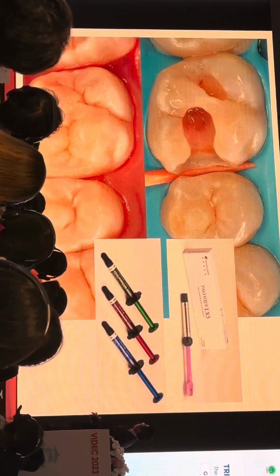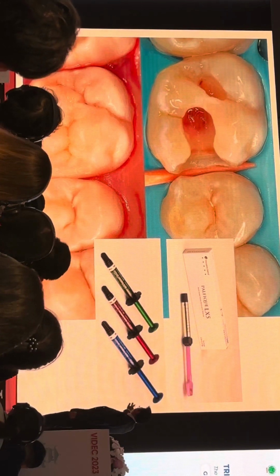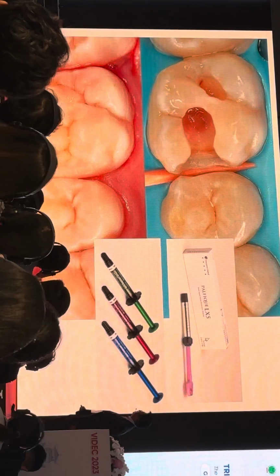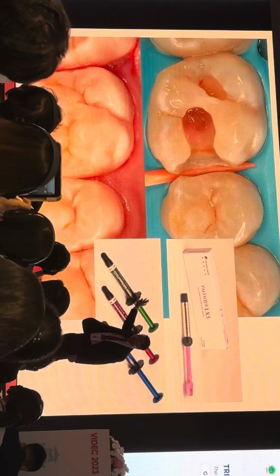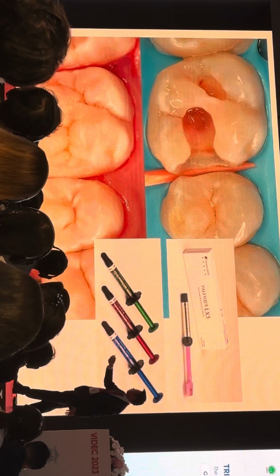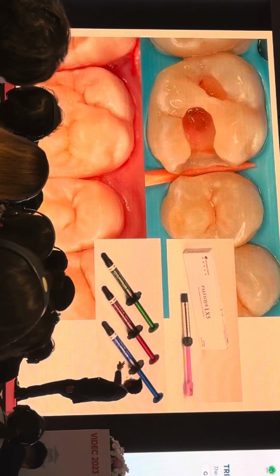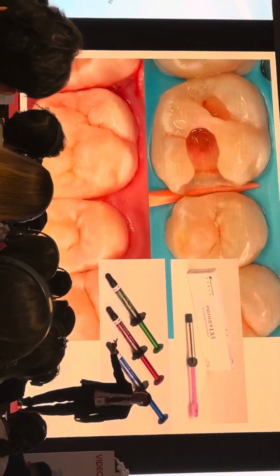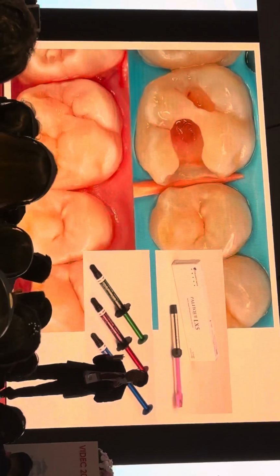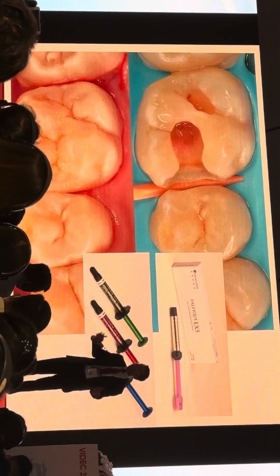And how do we do class 2 restoration in Japan? We use this latest composite, this one. Flow composite in combination with a paste type composite. We place bonding. After we place bonding, we put the metal matrix, okay? Metal matrix, just an image, we place the metal matrix. And with this latest flow composite, this is a universal type flow composite. If you have a big cavity, fill the whole cavity with flow composite, no problem.